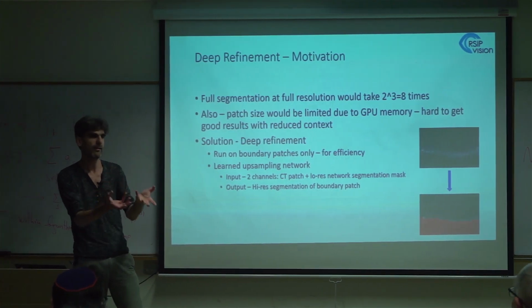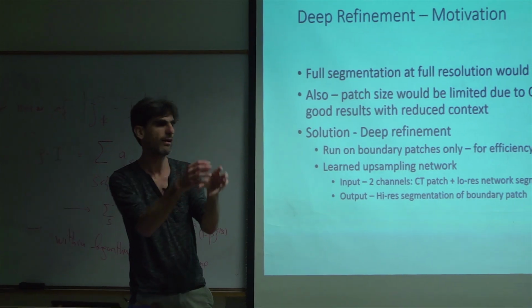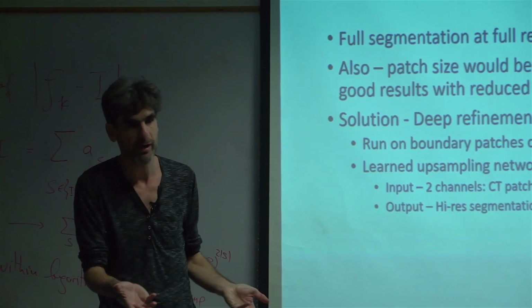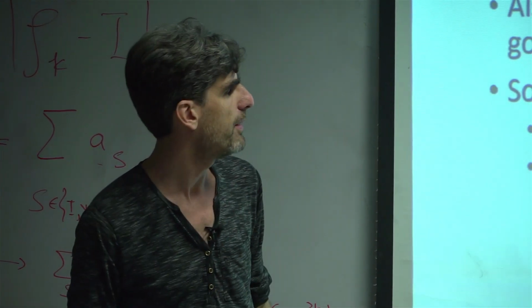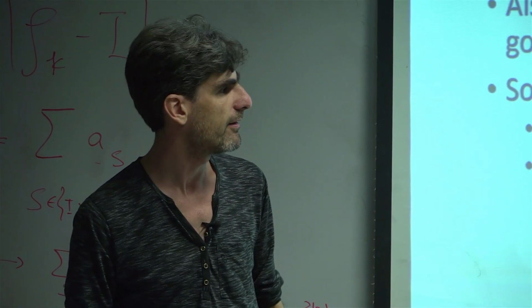So once we have a rough segmentation, we don't care about this whole volume. Most of the inside of the bone, we know it already. All we care about is the border regions. All we care about is to have an exact boundary and to learn that.